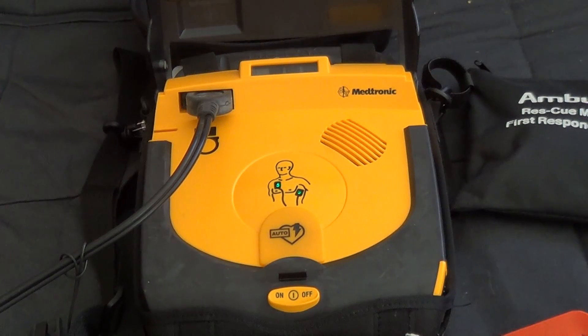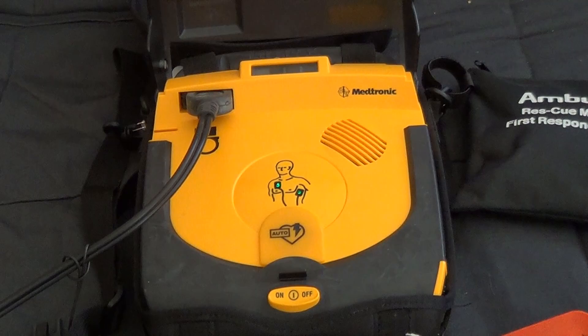Provide chest compressions and rescue breaths. Continue care.